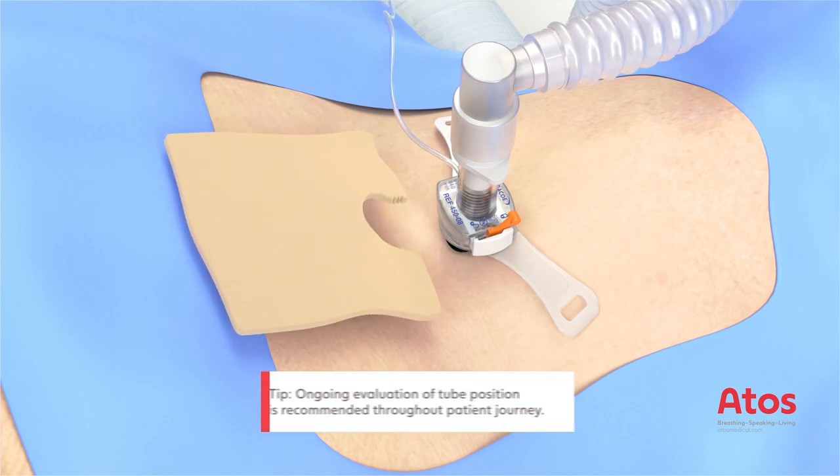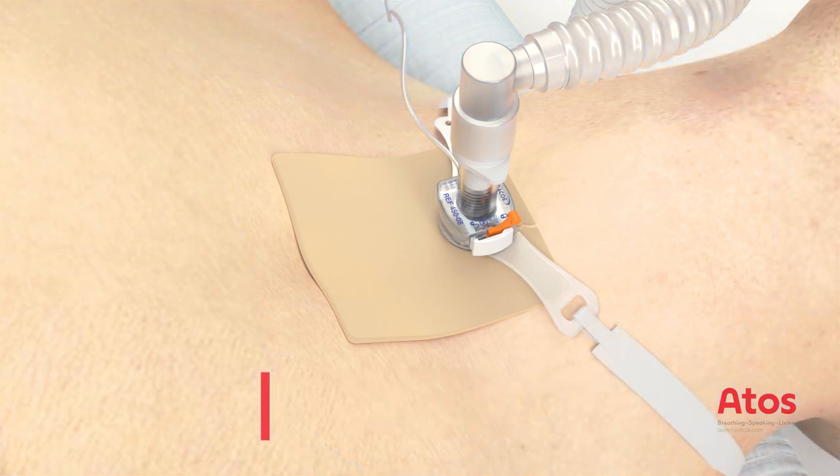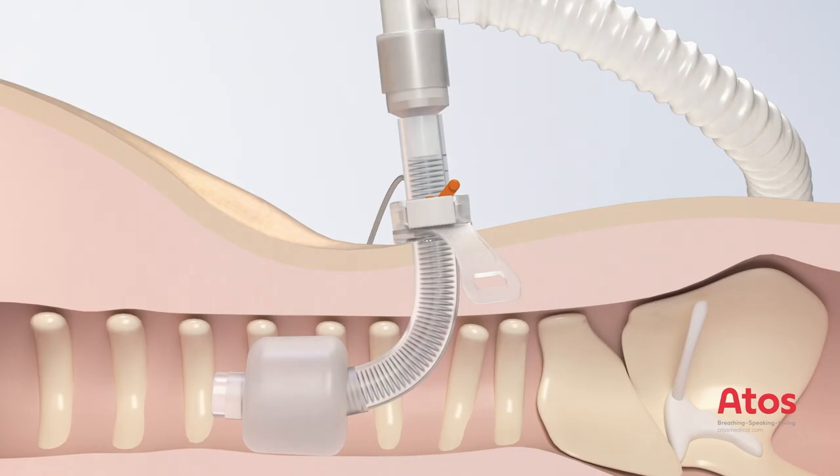Place a dressing under the neck flange and fix the tube in place with the neck strap. Now, the cuff pressure should be checked, for example with the aid of a handheld manometer.